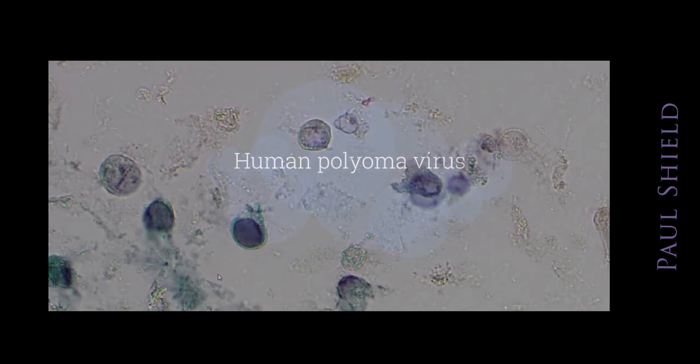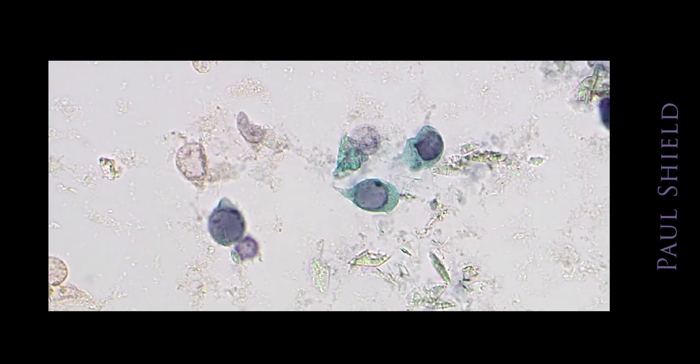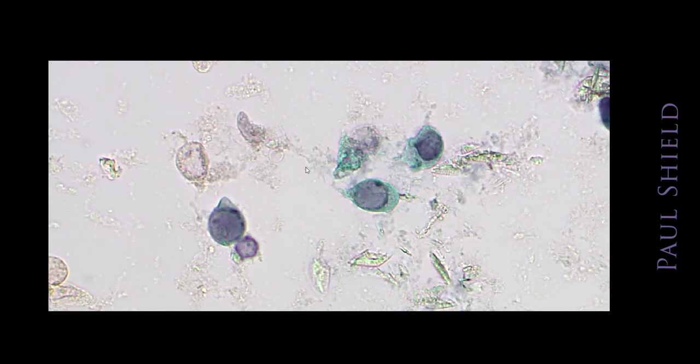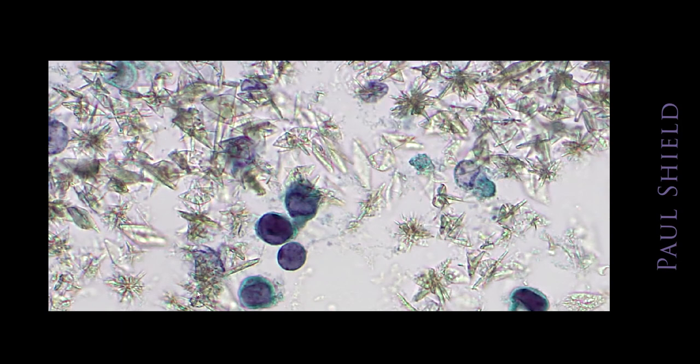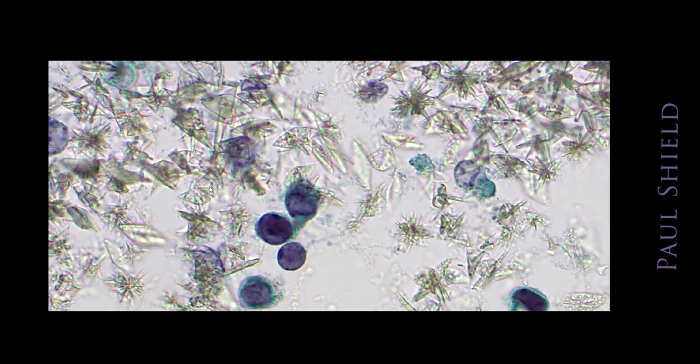So the most significant infection is human polyomavirus, and it shows typical viral change to the nucleus. These are the cells. They have quite a very high NC ratio, which is a little worrying. But notice the chromatin on these is just glassy and bland. It's got no granularity to it at all, and it's marginated. There's just incidentally quite a lot of crystals in this, but these are polyoma virus infected cells as well.